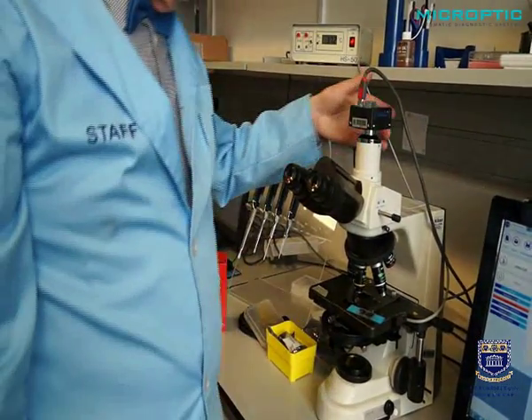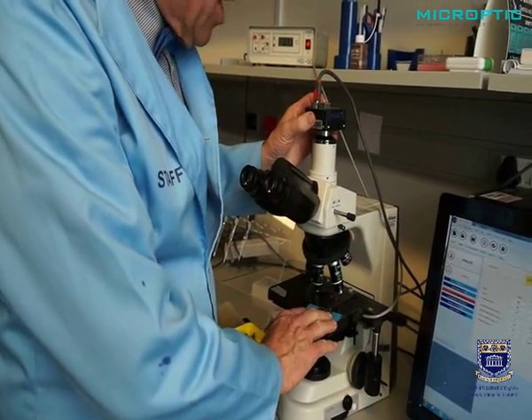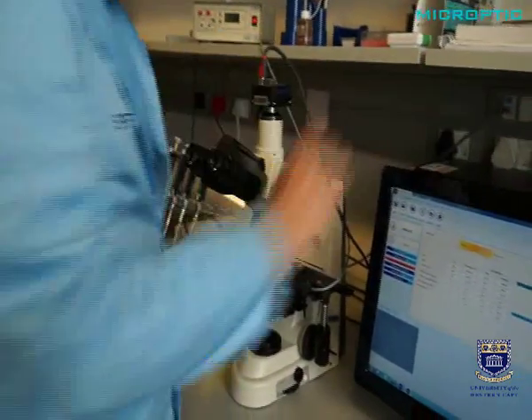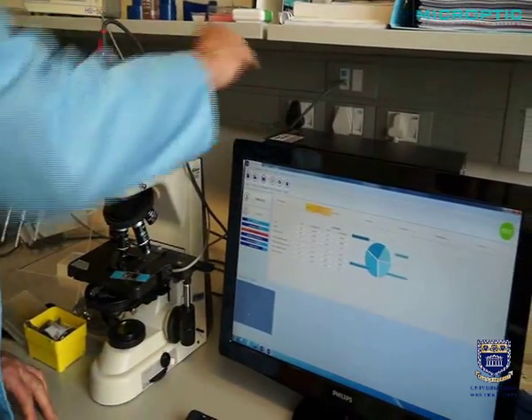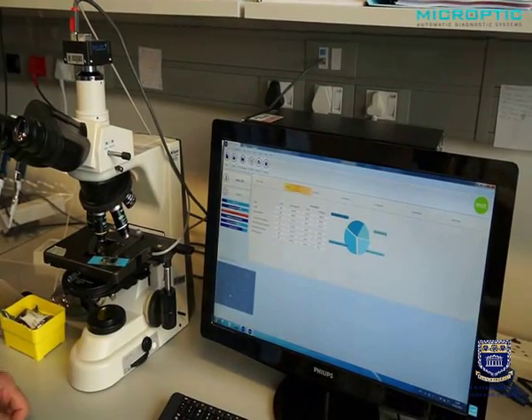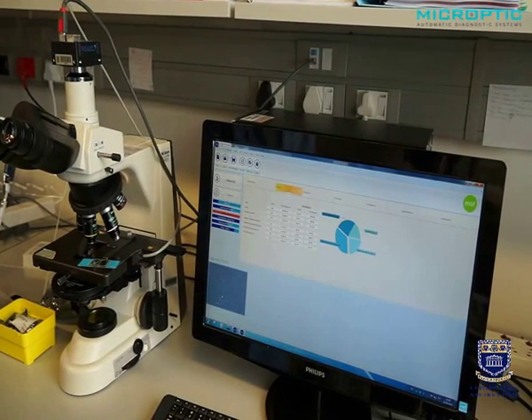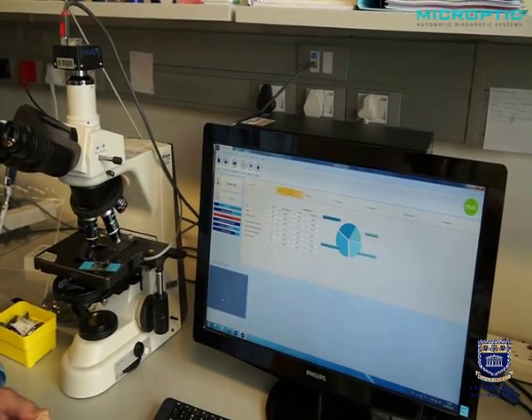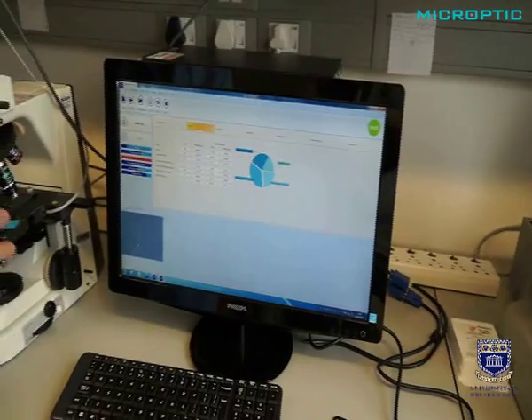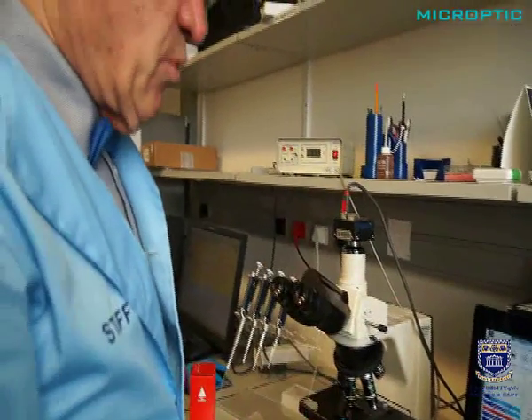The next step is that this signal, for example the motile sperm, is now fed into your computer. And again, here one must take a great deal of care. You cannot just use a computer with any settings. It's preferable to use a Hewlett-Packard computer with lots of RAM and very fast processors, and make sure that if you work with Gigabit Ethernet, it has the proper Gigabit Ethernet card at the back. So those are the absolutely important requirements for being able to start your work at all.